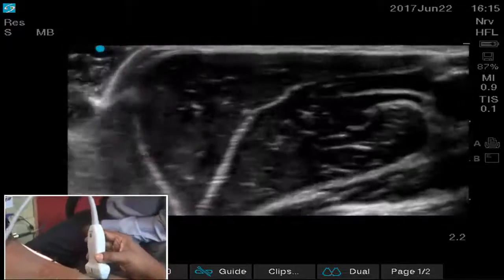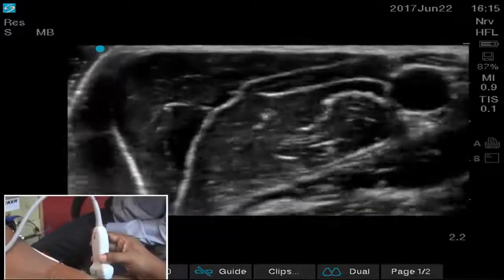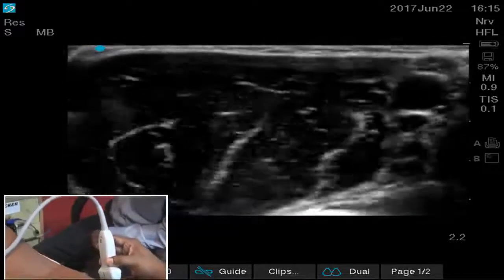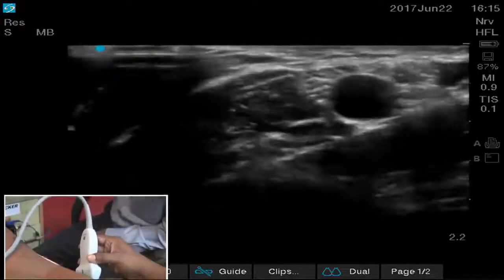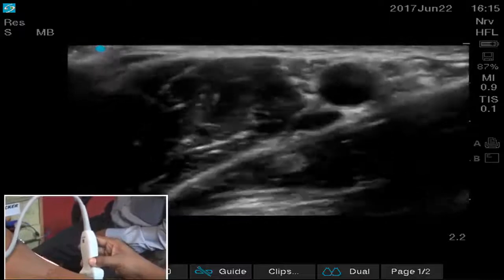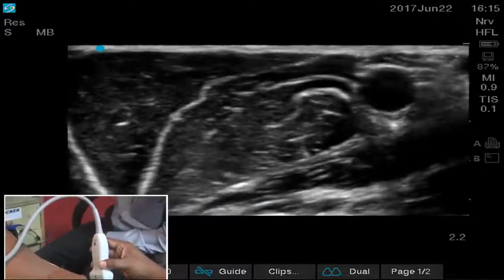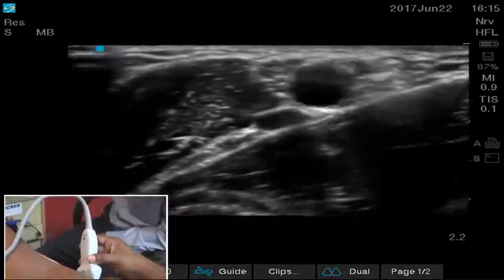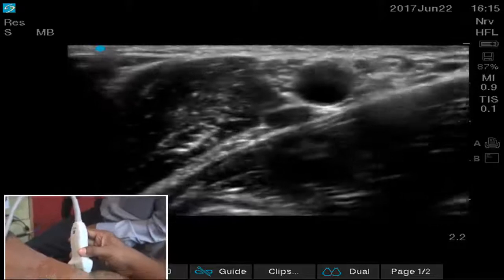And then the musculocutaneous nerve, sometimes you can see it here because it is originating very late. So in these patients you can block it here itself. If it is not given off even at a much lower level and you are not able to identify it, then if you block it at this level itself, the musculocutaneous nerve will get blocked.